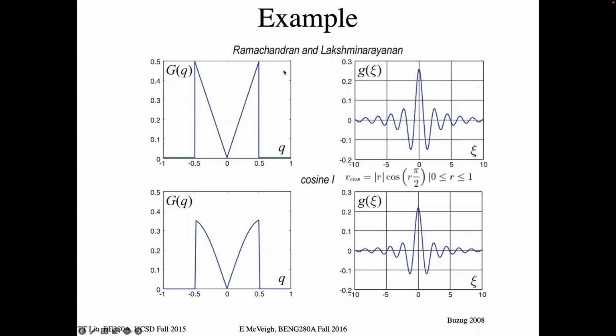So here you go. It's called the Ram-Lak filter because those of us who are incapable of remembering this guy's name can at least remember Ram and Lak. It is the simplest analytical solution to this thing, other than the fact that you've got to decide where you're going to truncate it. It makes life a little better, and images a little smoother, let's say it that way.